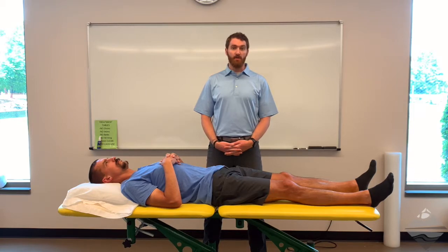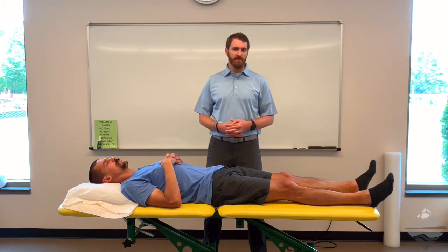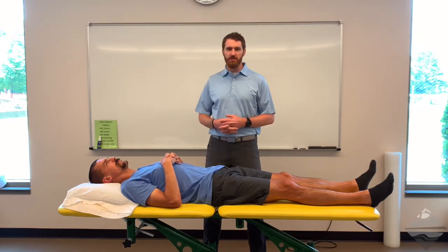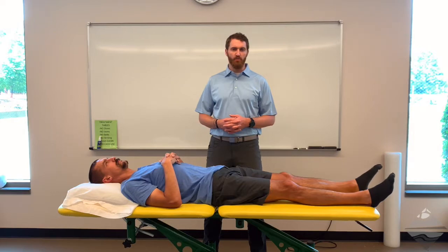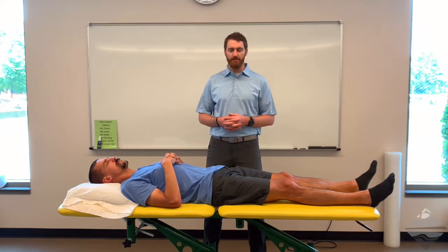For today's video, we're going to be talking about range of motion assessment for the glenohumeral joint. Because of the position of our patient, we're specifically going to be looking at passive range of motion with and without goniometric assessment, as well as overpressure and end feels. You could also look at active range of motion in this position; however, it is a gravity-eliminated or reduced position, so we would more than likely use a seated or standing position for that. Since our patient is in supine, let's proceed with passive range of motion.